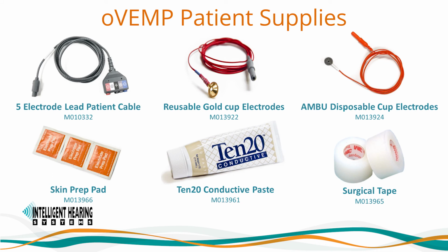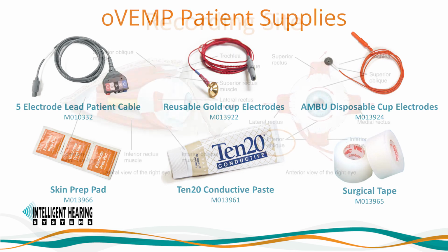If using a Duet system, you would continue to use the 5-electrode lead patient cable. To that patient cable, and to any Opteon system, you would connect the following electrode leads: reusable gold cup electrodes or AMBU disposable cup electrodes. The cup electrodes will require 10-20 conductive paste and surgical skin tape to adhere the electrode to the skin.